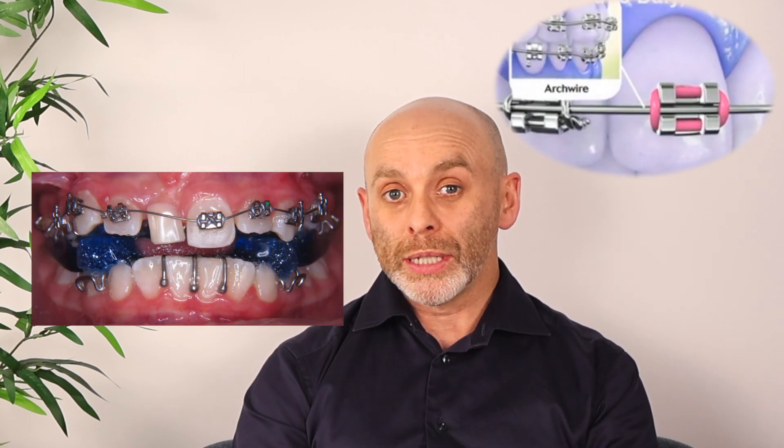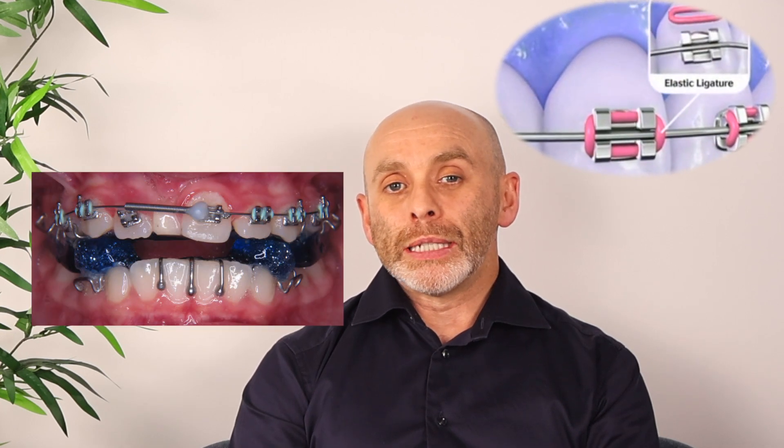Initially, Jenna had to have a short surgical procedure carried out under general anaesthetic to remove the dilacerated front tooth. Once this was complete, we then started her orthodontic treatment with train track braces, and you can see in the sequence of photos how we used simple orthodontic treatment to move her second incisor into the position of the missing central incisor tooth.